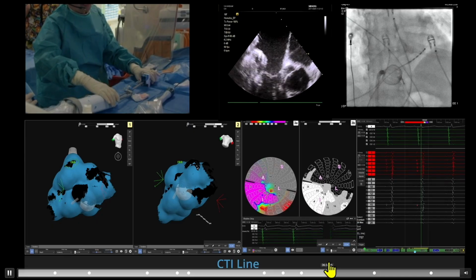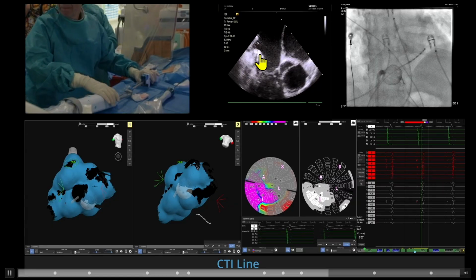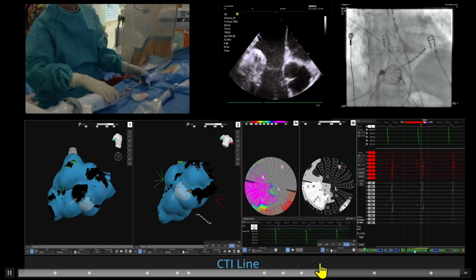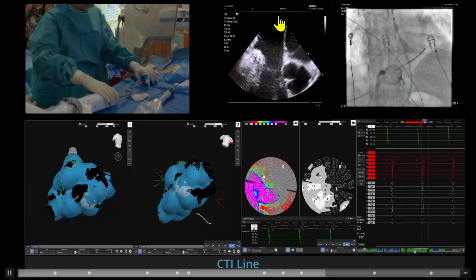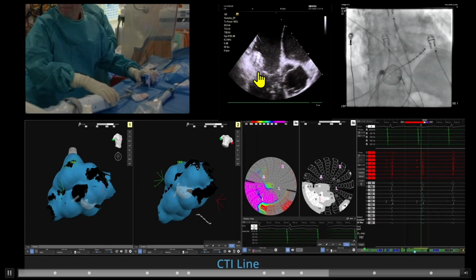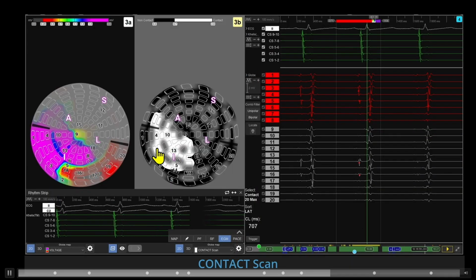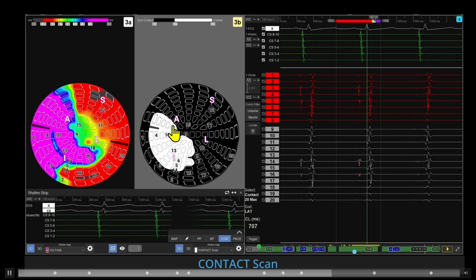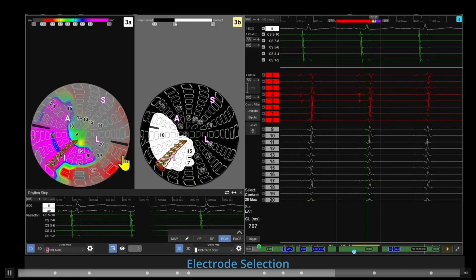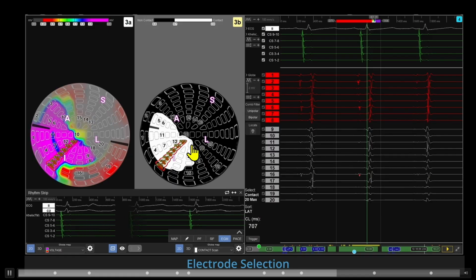I'm going to jump forward a little bit, in the interest of time. So here maybe I'll go back 1 second. Okay. Oh, I already deflected it. So it's deflected, and it's on the CT isthmus. You can see the tricuspid valve there. We'll run a contact scan here. And so we'll see that this is the voltage map, and this is the contact scan.